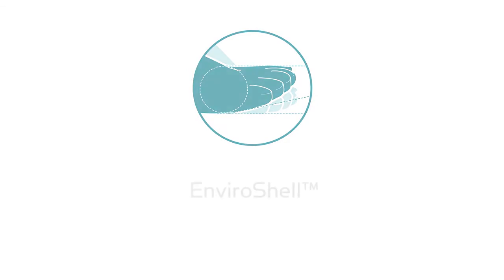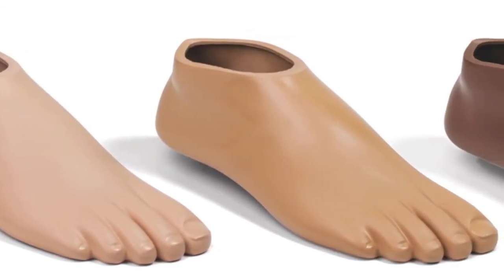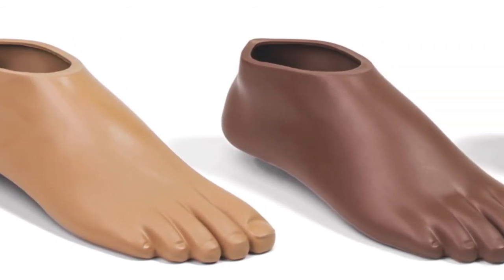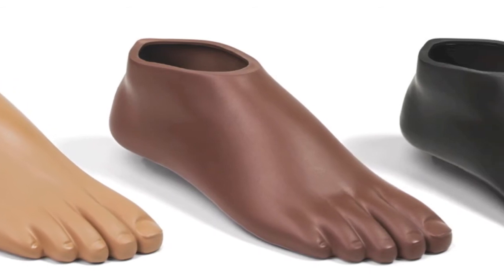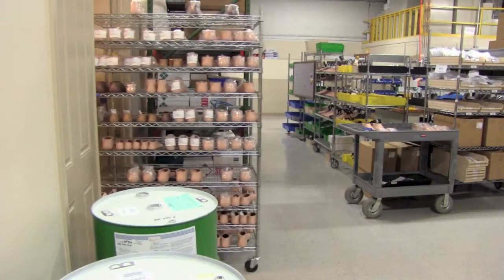College Park's EnviroShells utilize a custom foam polymer blend and incorporate impact dispersion technology into key areas, giving the foot shell ultimate durability. Our foam polymer is also infused with a UV inhibitor and pure silver for proven antimicrobial properties. This inhibits bacterial growth while also increasing the lifespan of the shell.